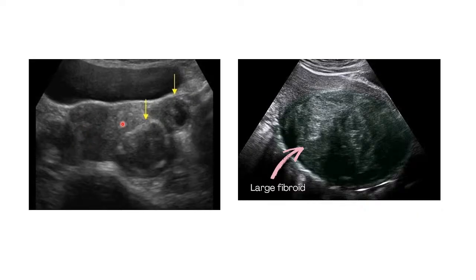It looks like it's also atrophic because these areas are very bright. Then there is another lesion, a mass here, that also appears like another fibroid, and you also have another fibroid with a cystic portion, which is showing signs of degeneration.